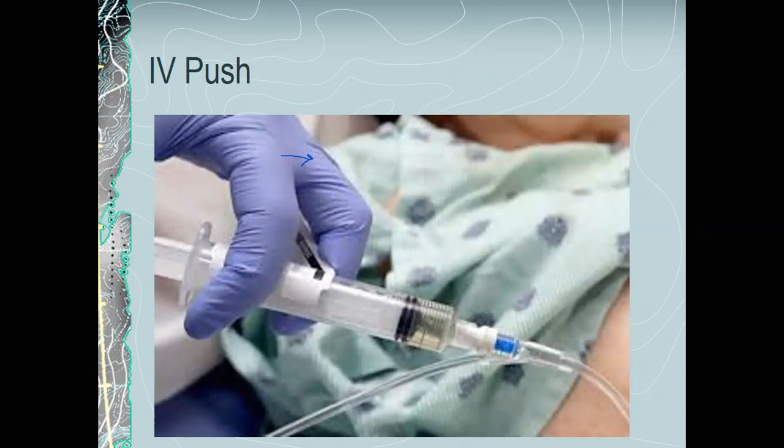Okay, and then IV push. As I said, with IV push medication, please be careful, because if you inject something too fast that does not need to be given fast, you will kill your patient. So please, please, please make sure that you are being medication specific and looking up how that medication is ordered to be given. So for IV push medication: vigorously clean the hub, flush before and after, check compatibility.